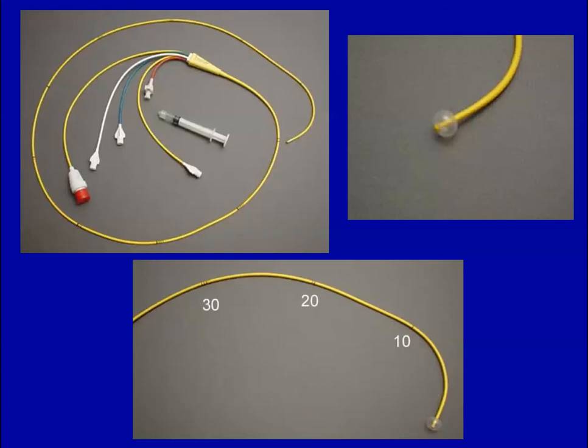This shows a simple pulmonary artery catheter showing the balloon at the end and the distance markers, which indicate 10 centimeters. So one mark is 10, 2 is 20, 3 is 30. When you get to 50, there's a wide marker, and then a wide plus a thin marker is 50 plus 10, etc.